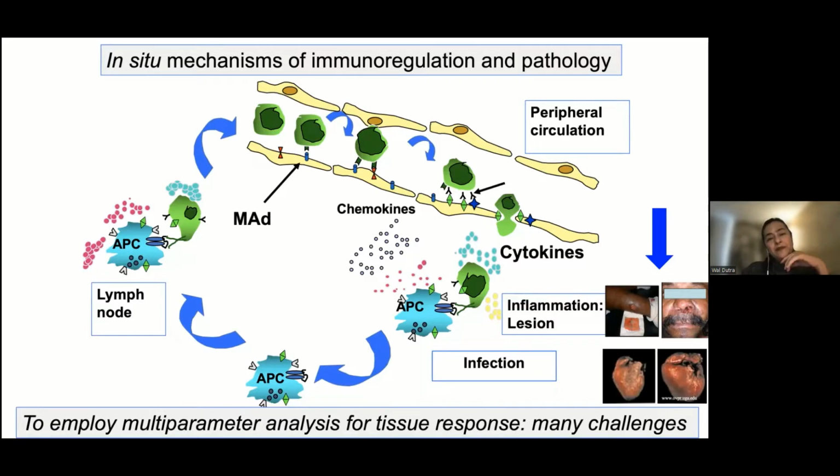And ideally, we would do it employing multi-parameter analysis that will allow us to identify many different components of the response at once.